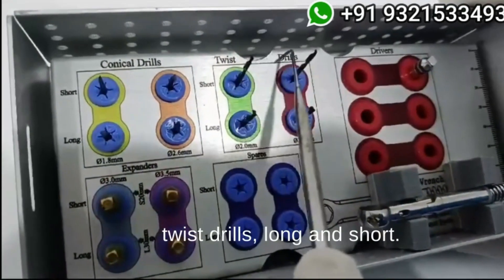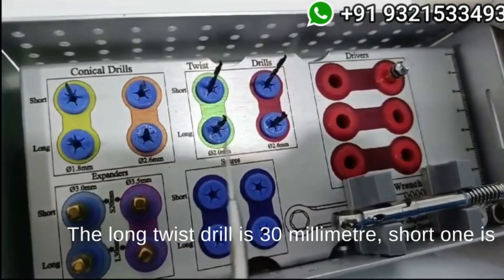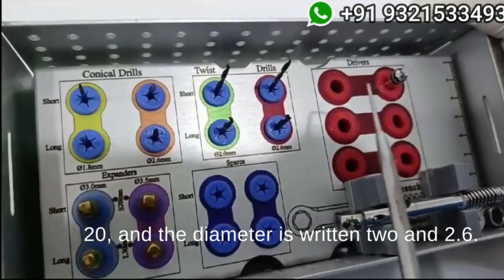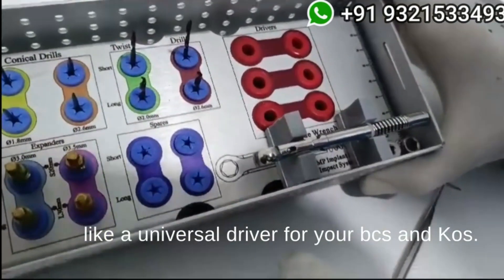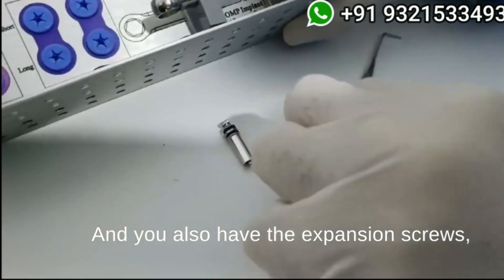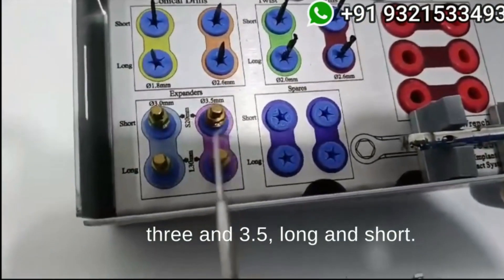Similarly, you can see here the twist drills — long and short. The long twist drill is 30mm, the short one is 20mm, and the diameter is 2 and 2.6. This is the slot for the drivers. Right now the driver available is this one, which is a universal driver for your BCS and KOS. You also have the expansion screws in 3 and 3.5, long and short.